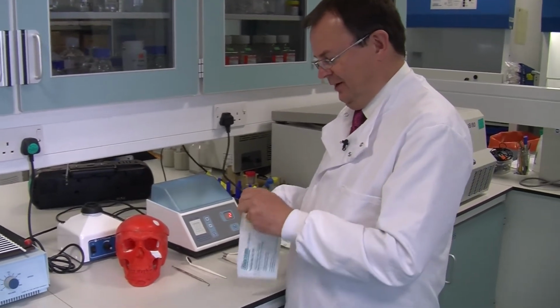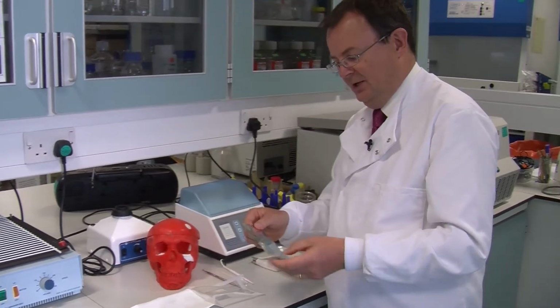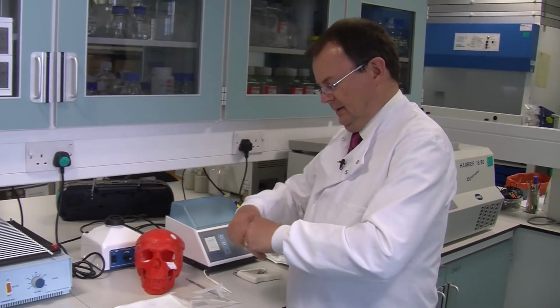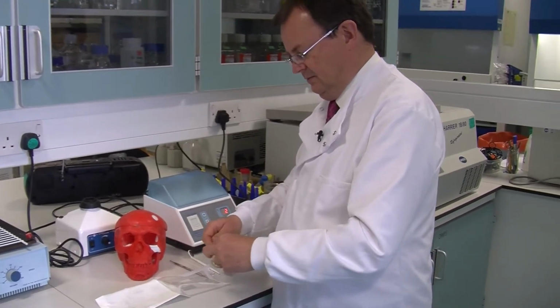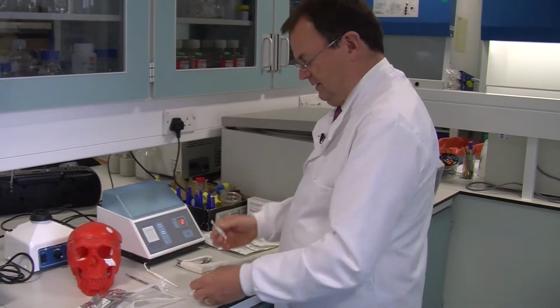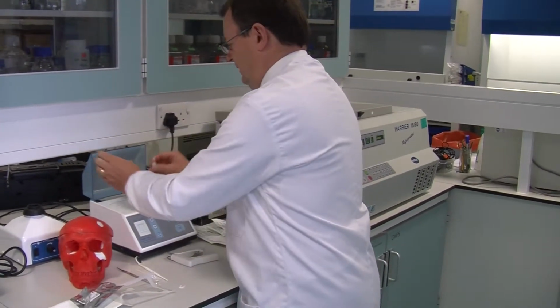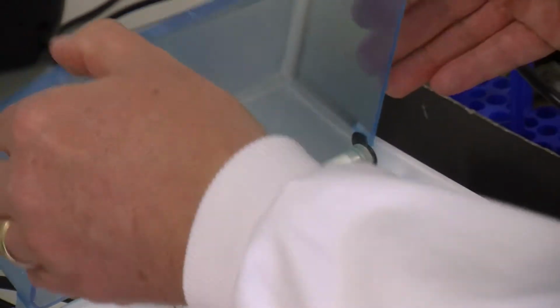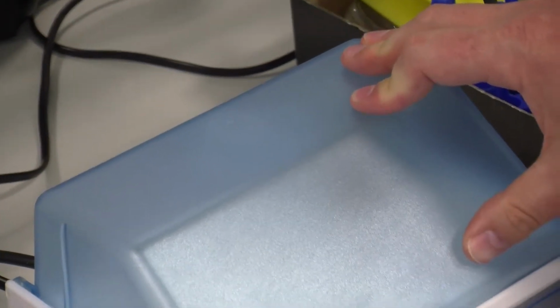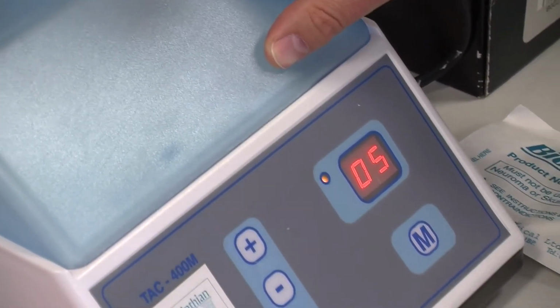It's a very simple system. If I were a surgeon, which I emphasise I'm not, this would arrive in the clinic. It's totally sterile. It's double bagged to protect it from moisture contamination. And then inside is a small capsule thus. And to activate it, again, it's relatively simple. You pull off the security tab here, activate it by hitting a plunger at the bottom, then place it in a little cement mixer. It just mixes for 10 seconds, and that adds the components together to form the setting cement.